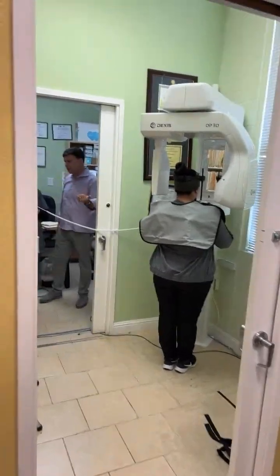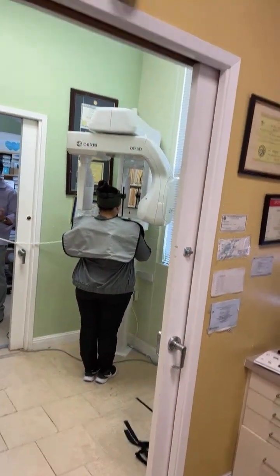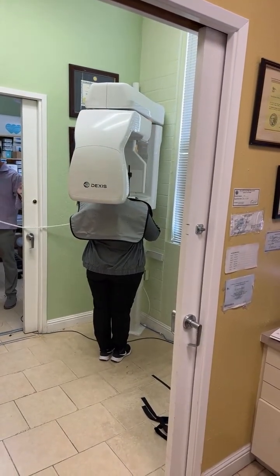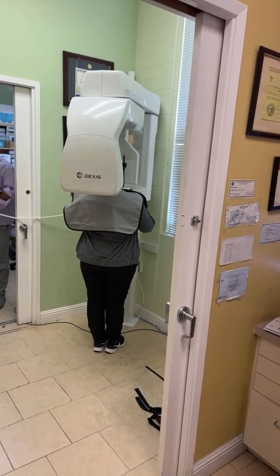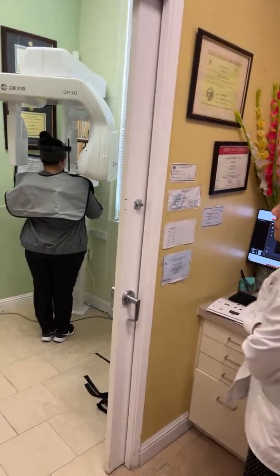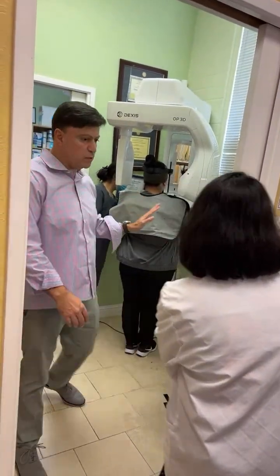You can come over here. You can see it. So if the patient moves, panics, or something hits their shoulder, you're still radiating. You just need to let go. The law requires that you have to see it. Keep it down, don't let go. You're going to hear a little chime. That's done now for the scout. Don't move, just stay right there.